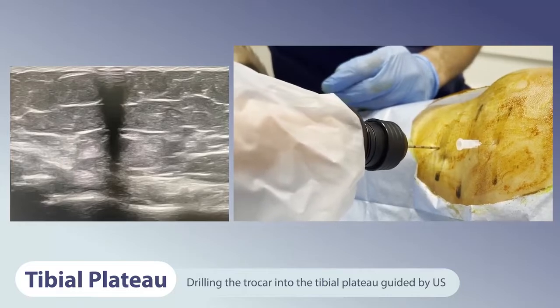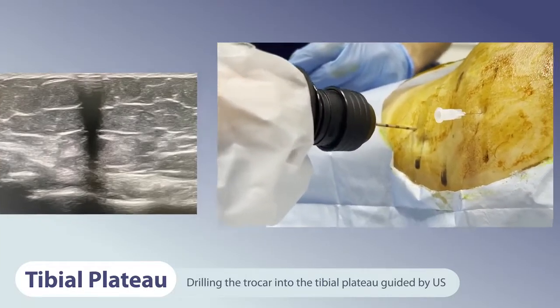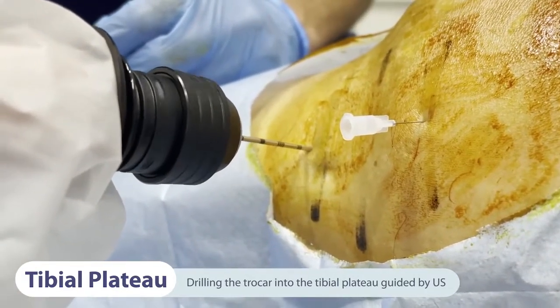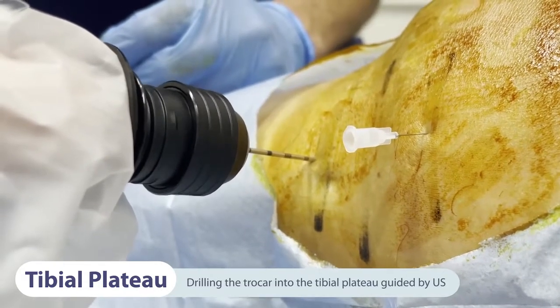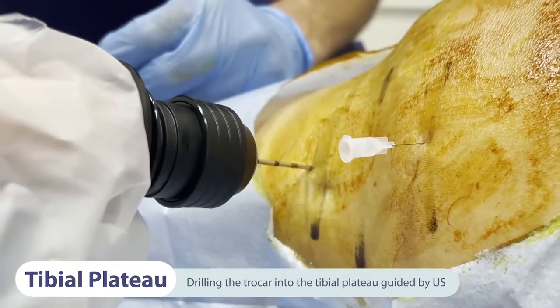We first address the tibial plateau by placing the tip of a 15G trocar biopsy needle system on the tibial entry mark point. We advance the trocar, making sure by using the ultrasound image that the trocar is placed 2 cm distal to the articular line with an inclination of 45 degrees and 1.5 cm deep into the bone.